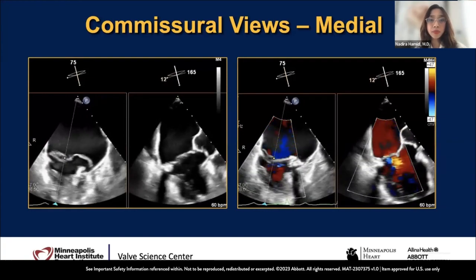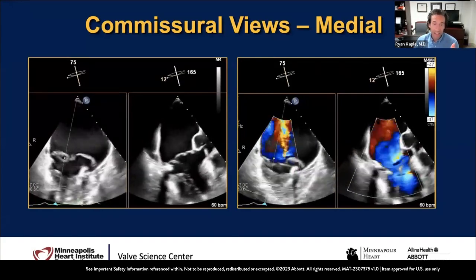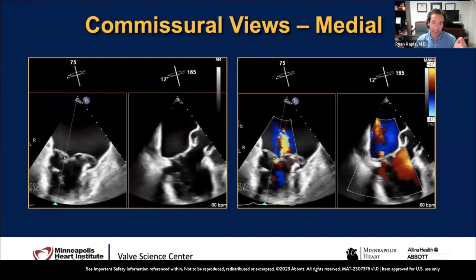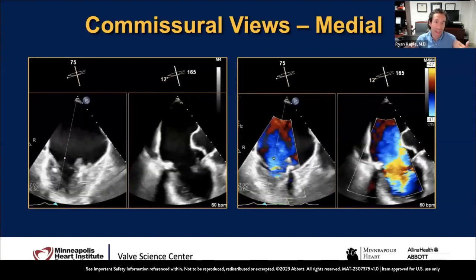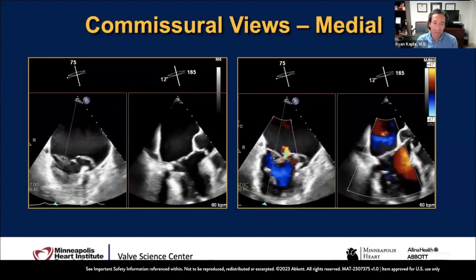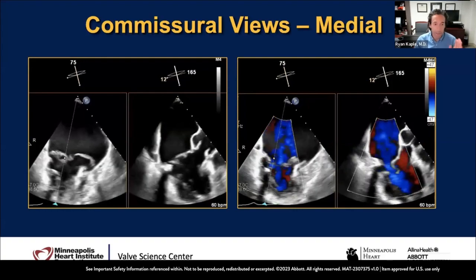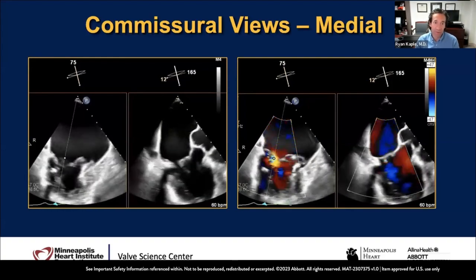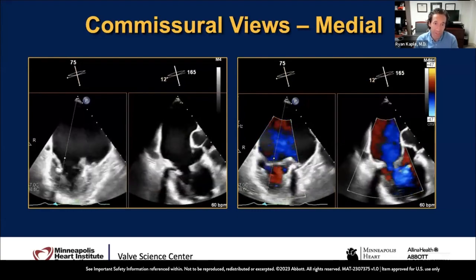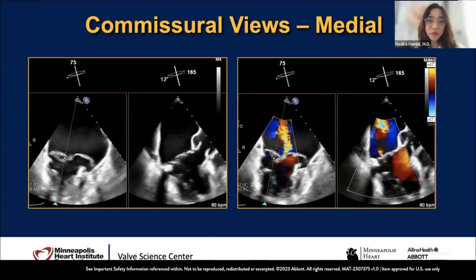It's a great point, Nadira, in terms of the leaflet length pre-imaging, because I always go back to the pre-leaflet length to get a sense of how much leaflet you actually grasped. I mean, you have a certain goal depending on the clip, whether it's 6 or 9 millimeters, but the only way to know that is to have a nice view, sweeping through from commissure to commissure. So wherever the clip ends up, you have a pre-image view to get that pre and post leaflet length. That's right. And I would advocate, take your time.